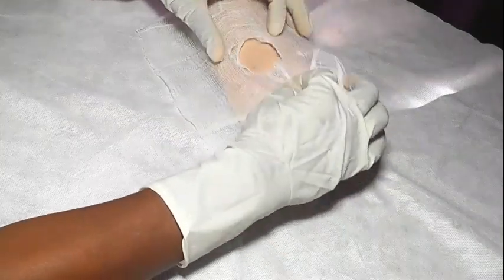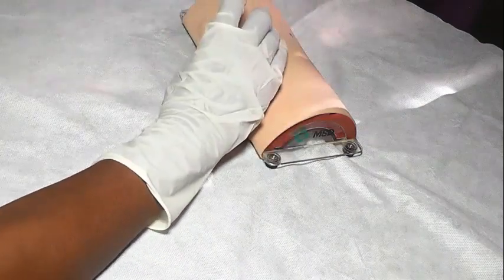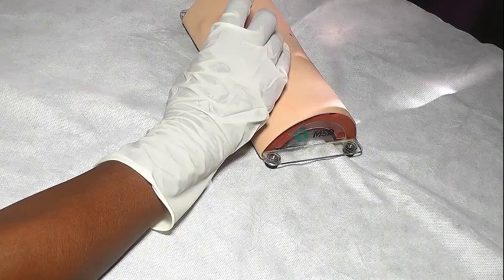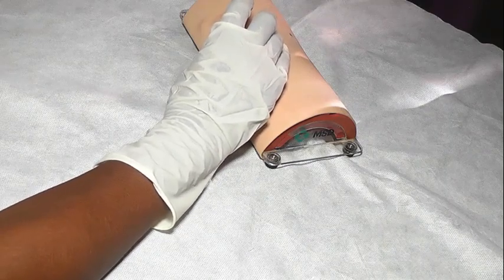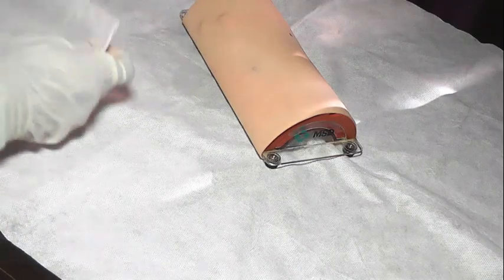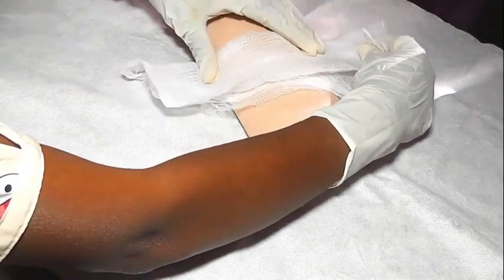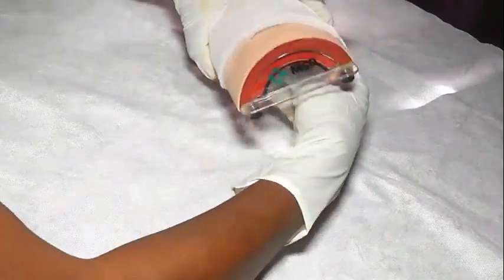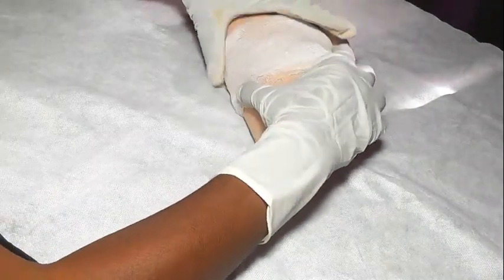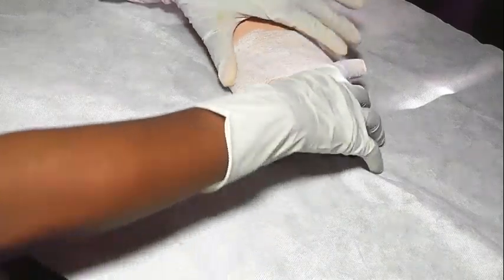Then you apply a sterile dressing to the side so that there will not be gushing of blood. So you apply dressing on the side. Usually some use a gauze and a plaster, but you can also tie the arm. You can also use gauze to tie the arm. Okay, with a mild pressure, this will reduce the gush of blood. Then you make the client comfortable and then you record everything.